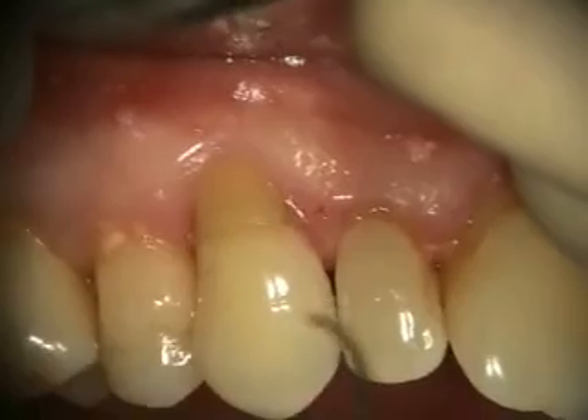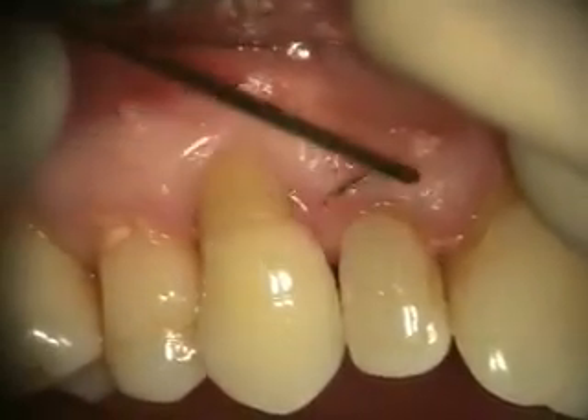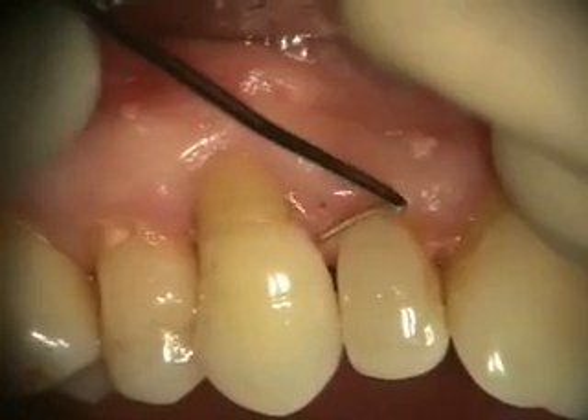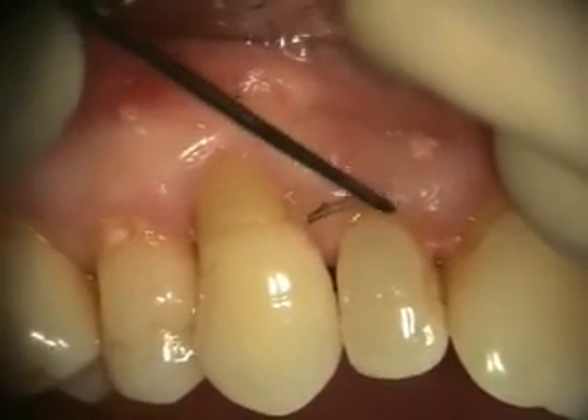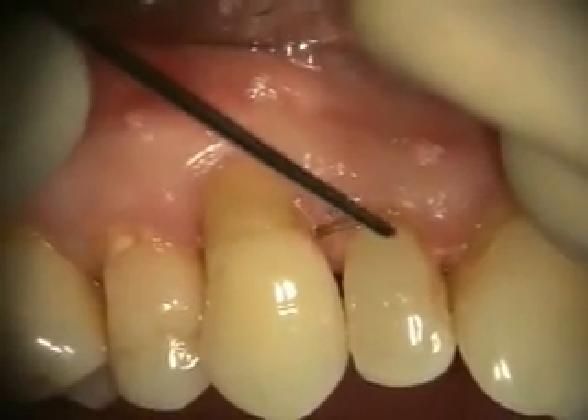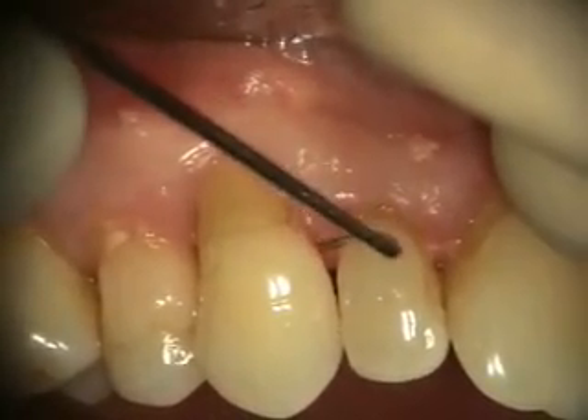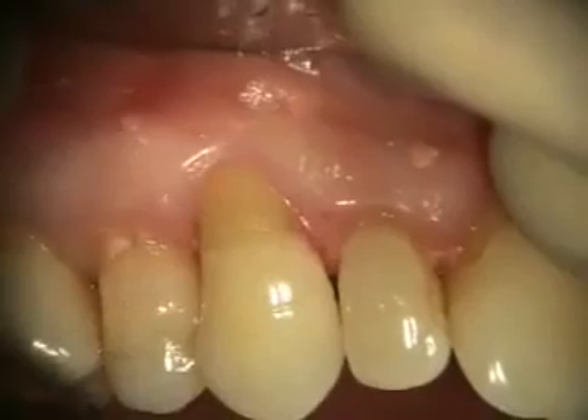Today we're doing a Geristore repair. There are some root resorption areas on the mesial of number six, and you can see where it's going in. I'm going to have to reflect the flap and expose this area through the Geristore repair, and I'll suture it back.